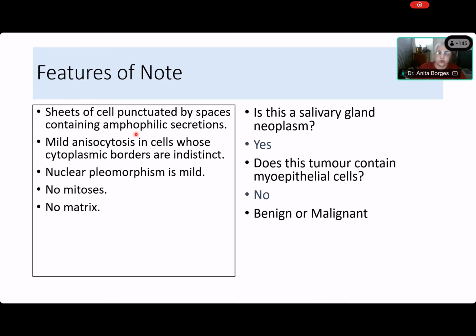Very good. Now you have got these 6 or 7 tumors to choose from, right? Is it a Warthin tumor? No, ma'am. Is it an acinic cell tumor? No. Is it a salivary duct carcinoma? No. Is it a mucoepidermoid tumor? No. So what is left? Secretory carcinoma and clear cell carcinoma, right? And it's not clear cell, so it's secretory. So see, it is so simple.